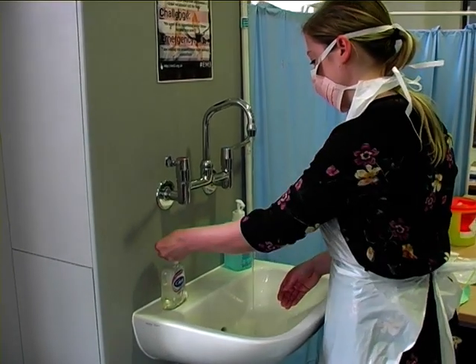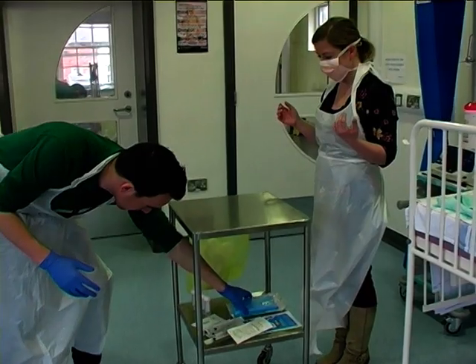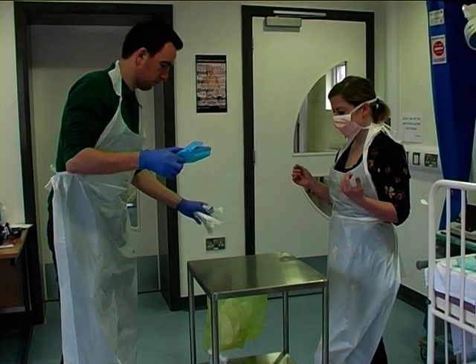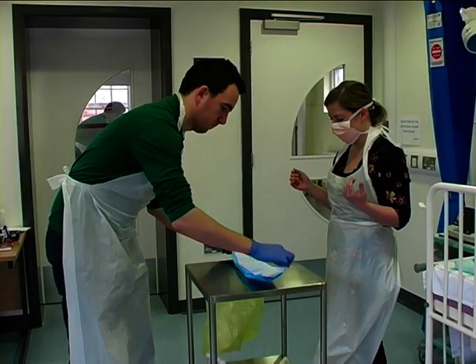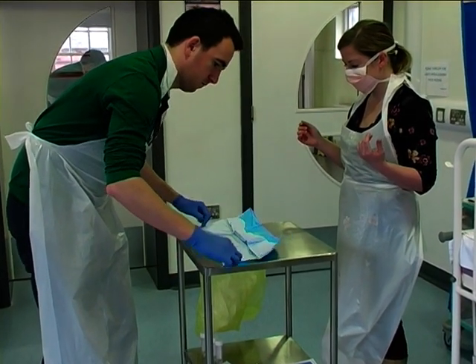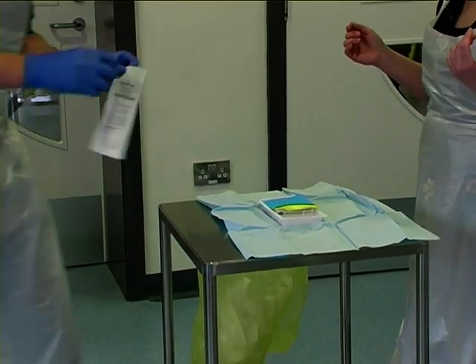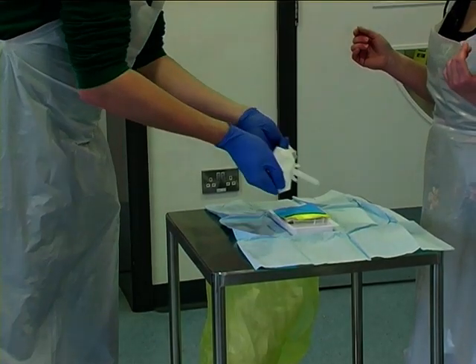You should clean your hands appropriately using the seven-step technique. At this time, ask your colleague to assist you by opening the sterile pack on the clean trolley. Following this, your assistant can then provide your sterile gloves, ensuring that it is the correct size and fit, and also open the cleansing solution and other equipment needed, doing so in a sterile manner.